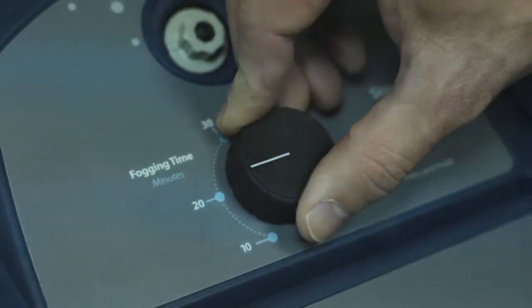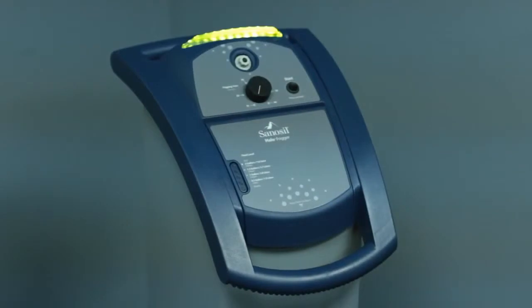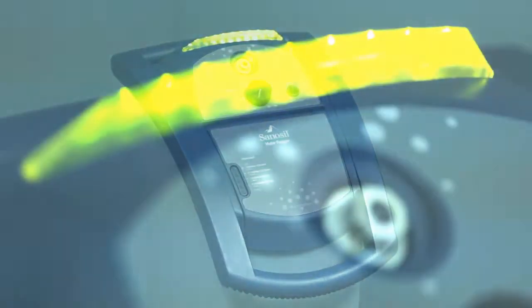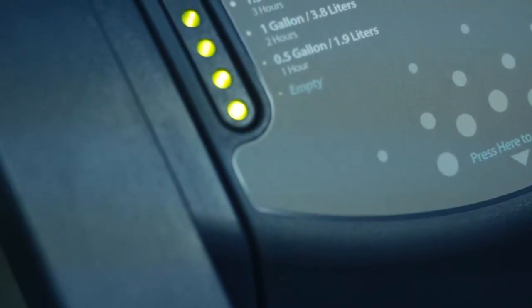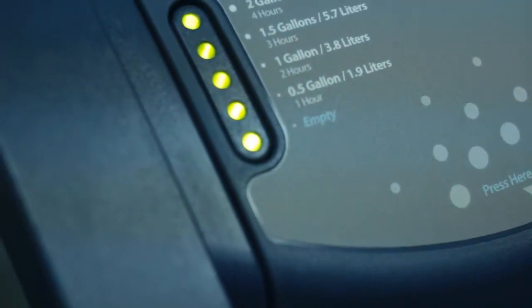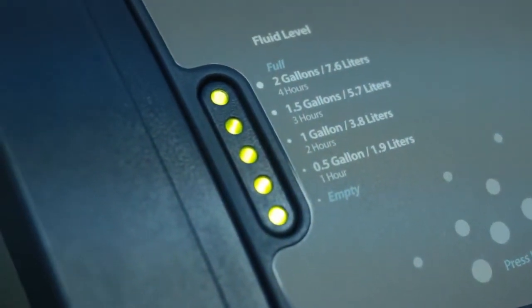Once the room is prepared, plug the Halo into any standard wall outlet. Upon plugging in the Halo, the status indicator light will illuminate green indicating the Halo is ready to use. The fluid indicator lights will also illuminate to let you know the level of fluid in the reservoir and if you need to add more Sanosil disinfectant.